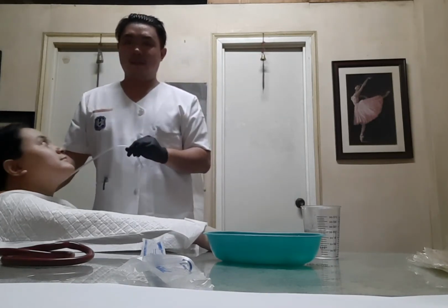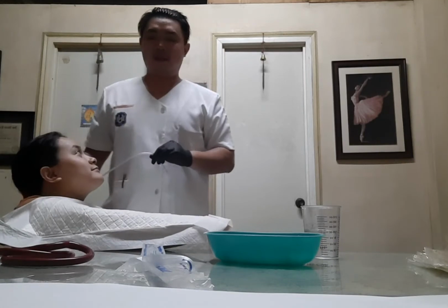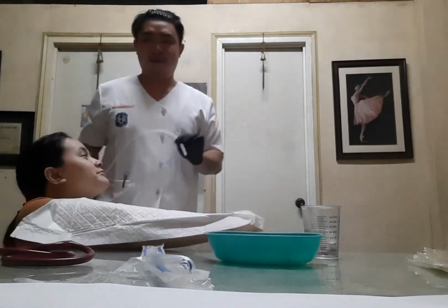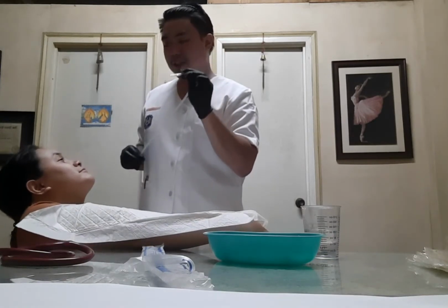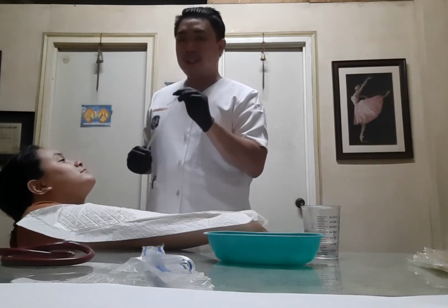One thing, it's a video. Yeah. So I am assuming that I will be inserting the suction catheter at 80 to 120 set on the wall unit.